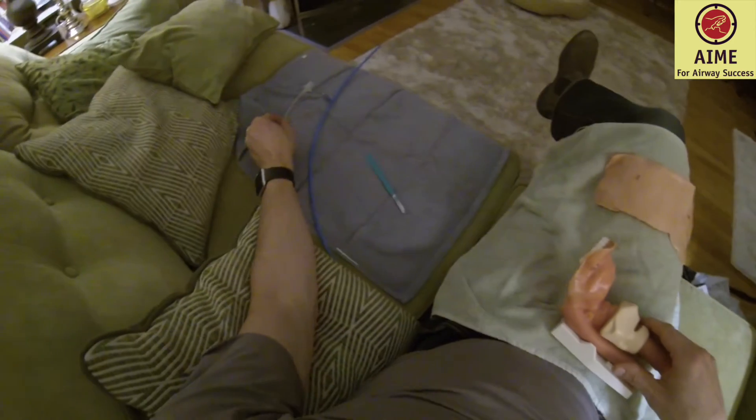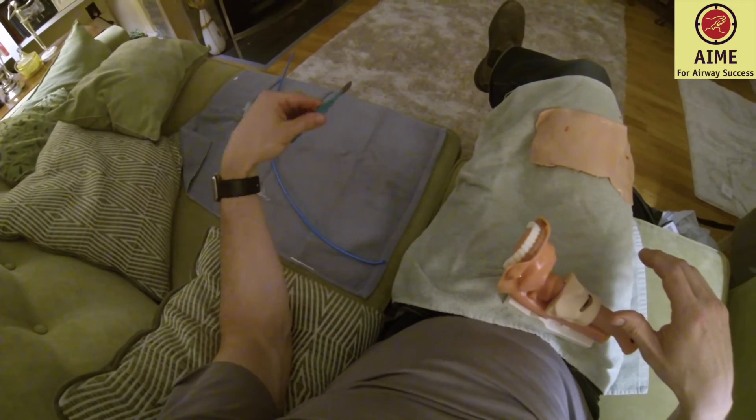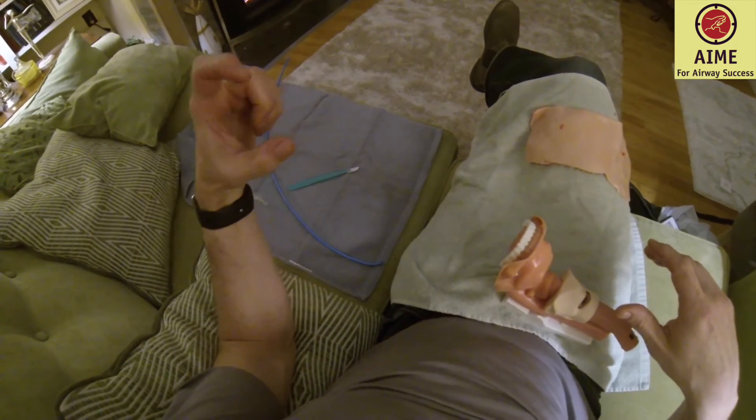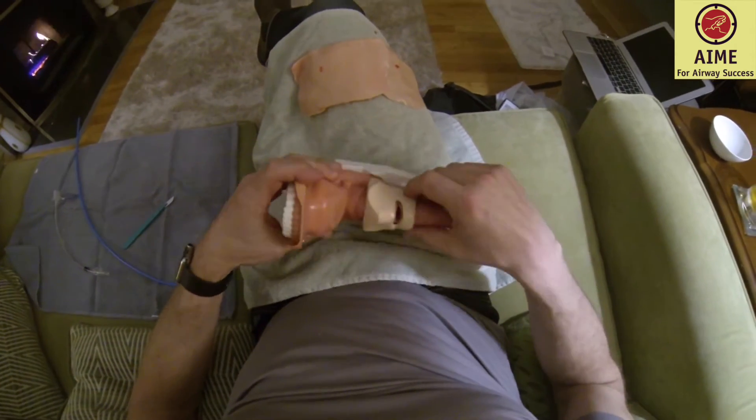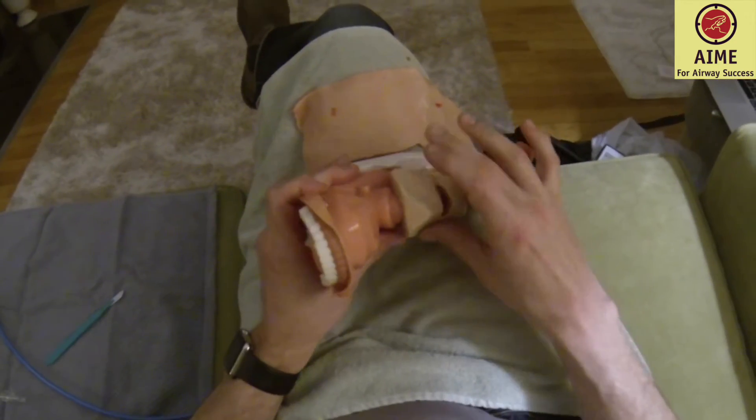I just wanted to go over a couple things and show you what we're recommending. It's a bougie-assisted cricothyroidotomy technique — a hybrid technique where you'll use the blade as a dilator, and if you're having trouble you'll use your finger as a dilator. First of all, let's just review the anatomy.